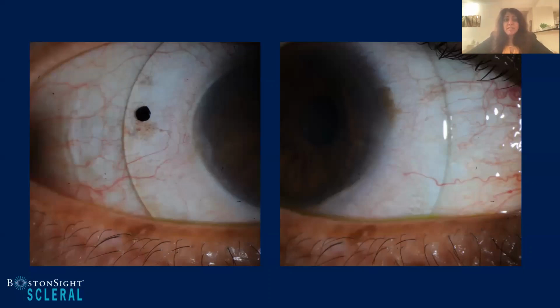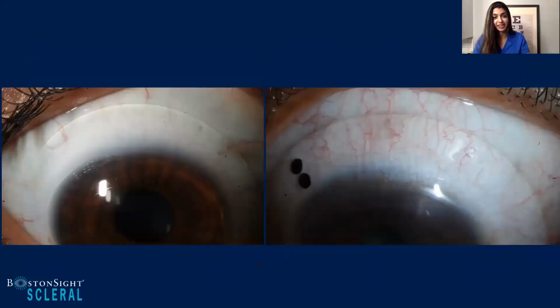What I would want to see is a little bit closer. I want to put some dye in here. I want to get more into it. I want to increase the magnification, see what's going on top and bottom, and really dive in a little bit more. You know, it wouldn't be a great case if I actually gave that to you, right? So I did instill dye. She had very slow tear exchange, but she did have some, so that was great. I knew that the lenses weren't suctioning off completely.